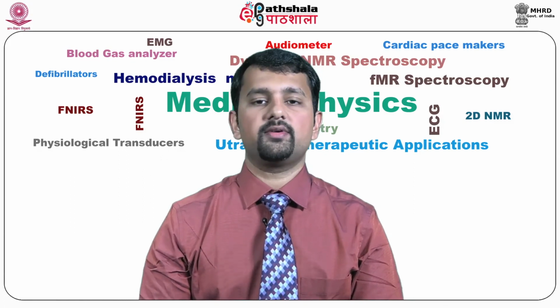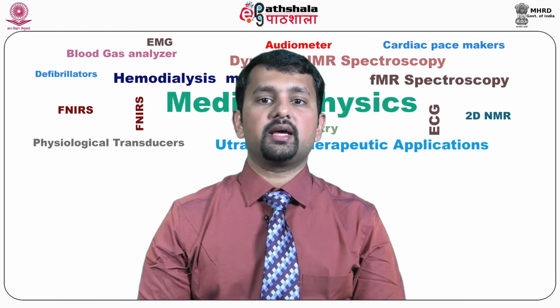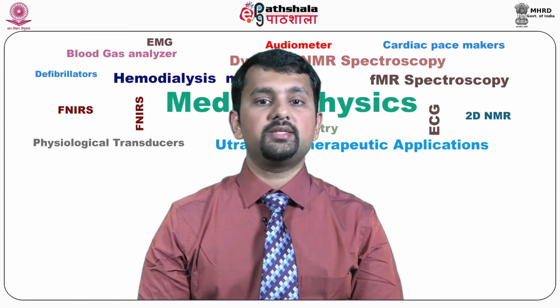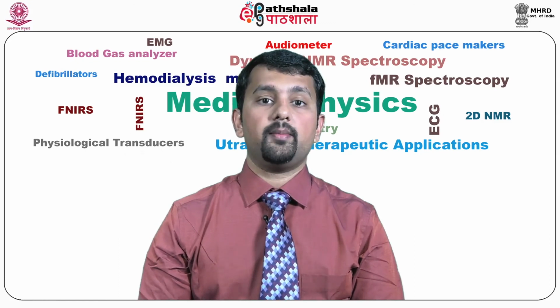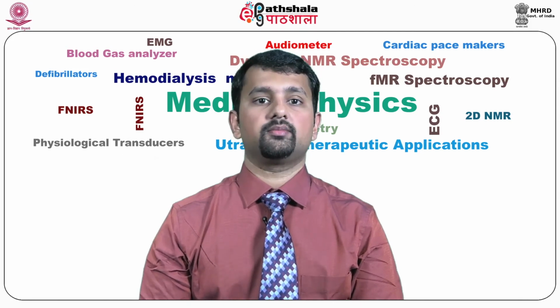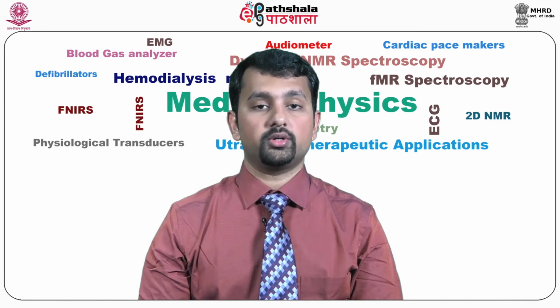We have discussed this previously, it is called shimming. Artifacts can arise from dental implants, proximity to sinuses, inclusion of bone in the voxel and lipid signals arising from bone marrow. Multivoxel MRS data is noisier than single voxel MRS. MRS is a very sensitive tool to motion.